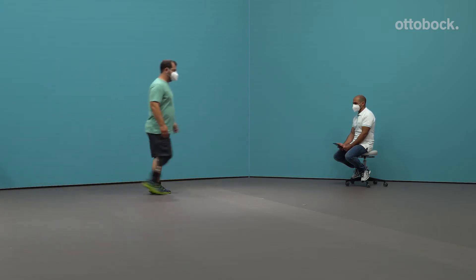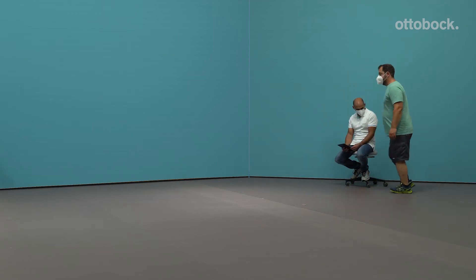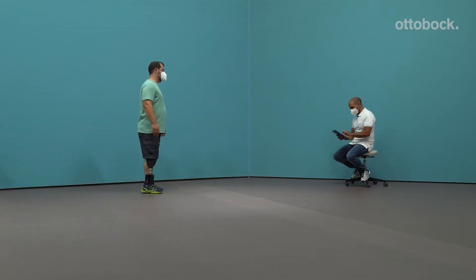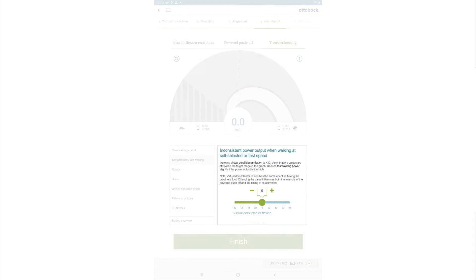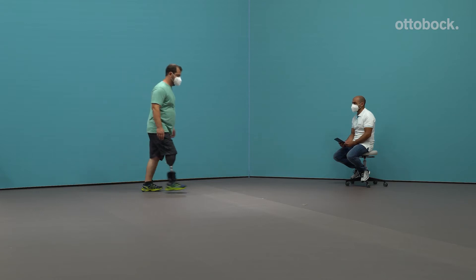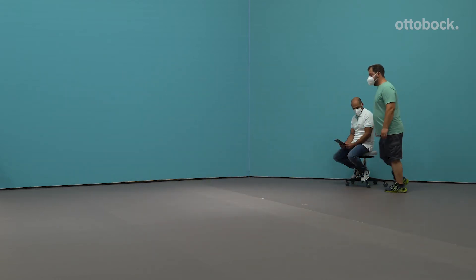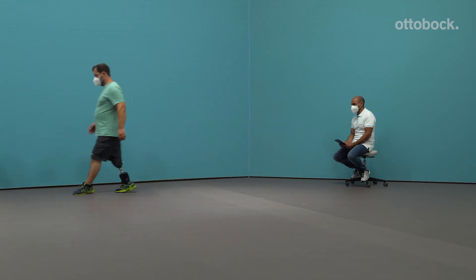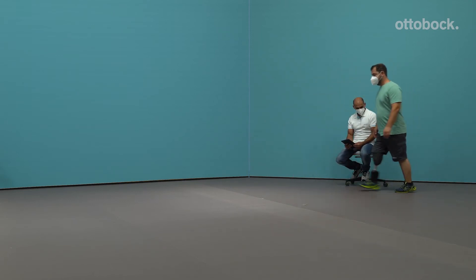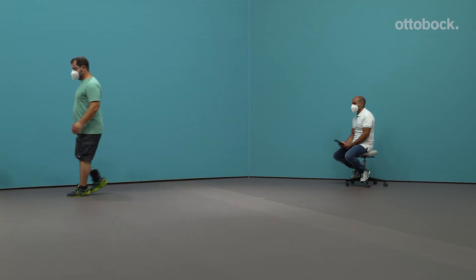The user reports the power output is inconsistent when walking at self-selected or fast speeds. Increase the virtual dorsal plantar flexion setting to plus 30. Verify that steps still plot in the optimal range of the power output graphic. Reduce the fast walking power setting slightly if the power output is too high. Virtual dorsal plantar flexion has the same effect as dorsal flexing (negative values) or plantar flexing (positive values) on the prosthetic foot. Changing the value influences both the intensity of the powered push-off and the timing of its activation.